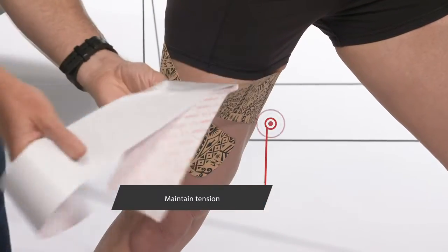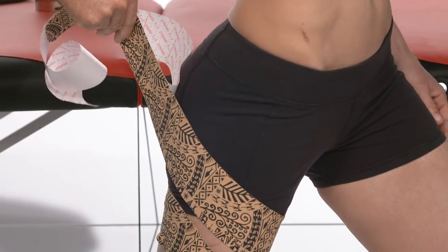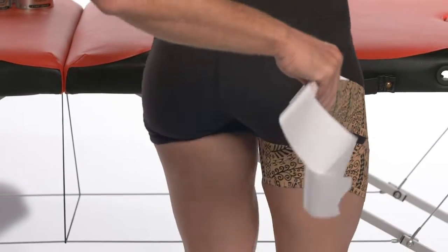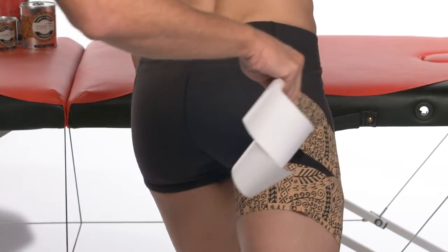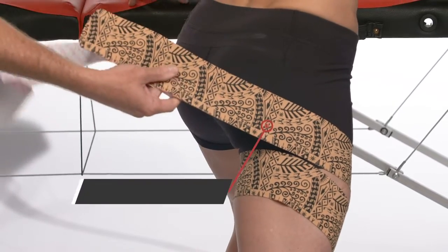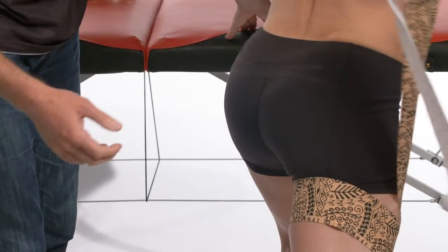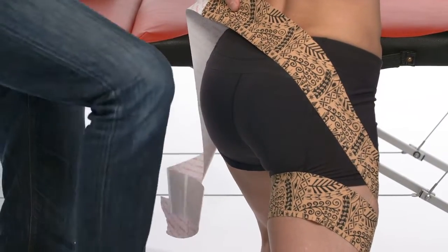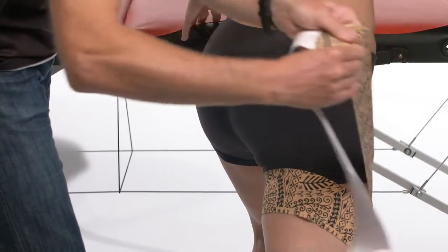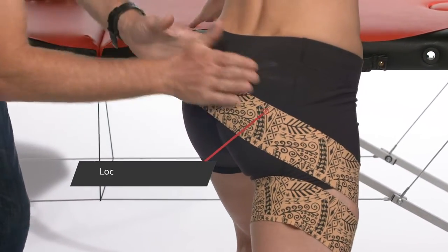The key here is that we need to come up behind the axis of the hip joint. If we come too high over the hip, we won't get any length change in flexion, so we won't get a hip extension moment. It's got to come quite low across the hip and then lock off with a nice anchor point on the other side.